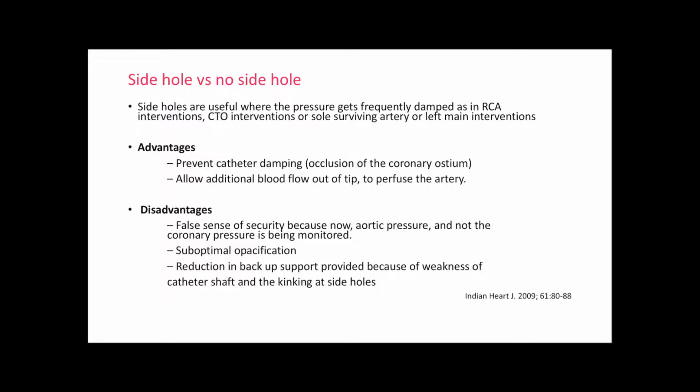But when you are using diagnostic or guide catheters, there are some catheters that have an end hole, and there's even a practice of putting a hole on the side to make it a side hole. So what is this side hole and end hole, and what purpose do they serve?